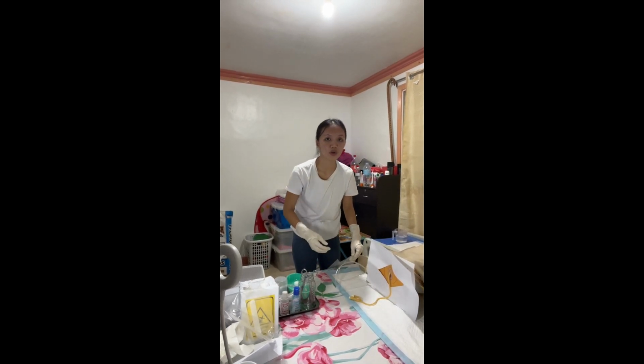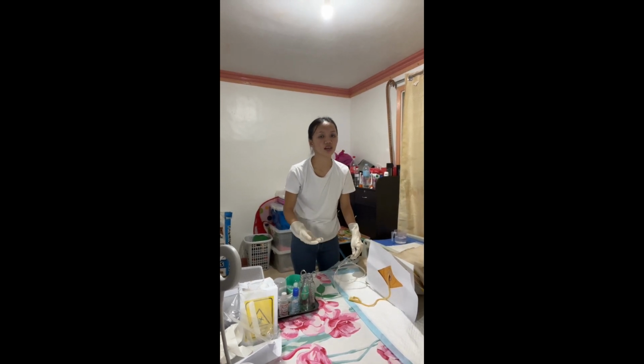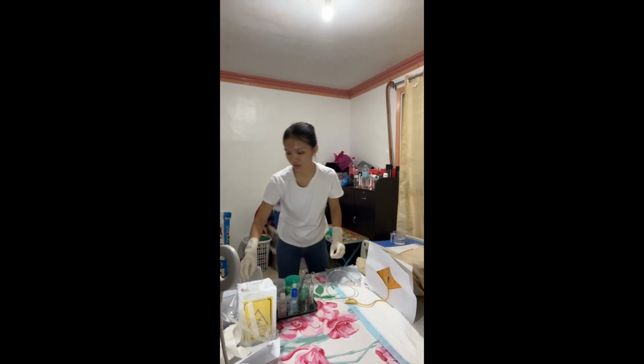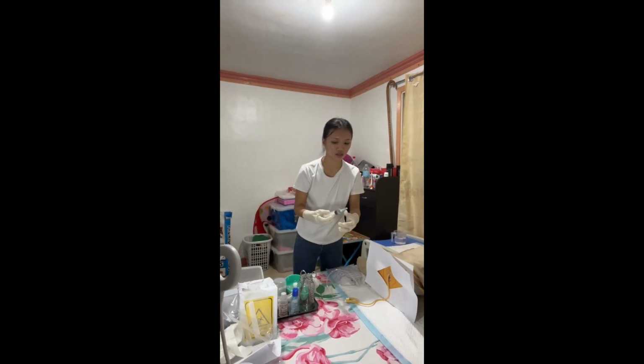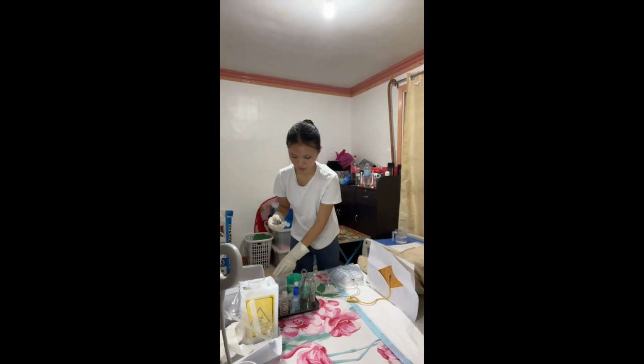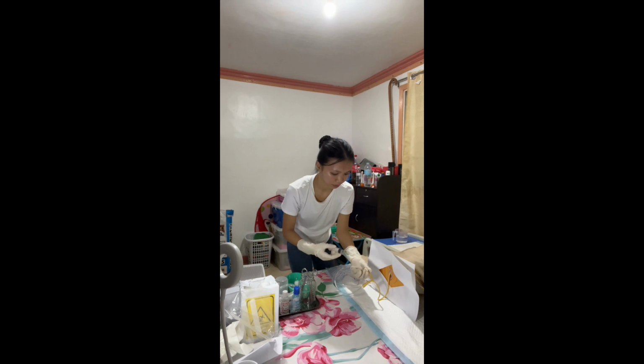Next, we are going to inflate the balloon with 10 to 15 cc of sterile water using our 15 to 20 cc syringe. So this is our 15 to 20 cc syringe, and we are going to inflate our catheter with sterile water.